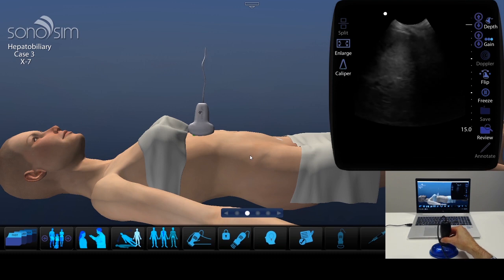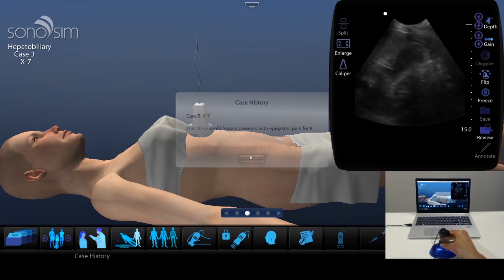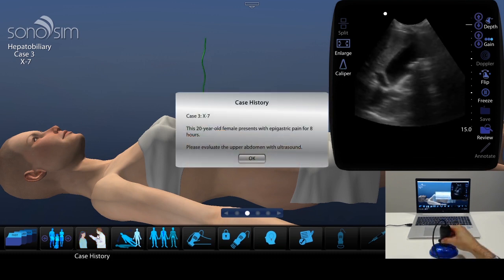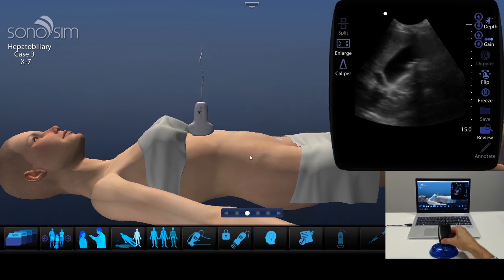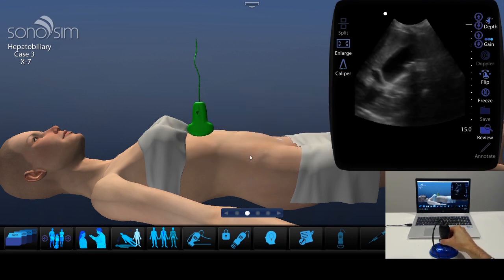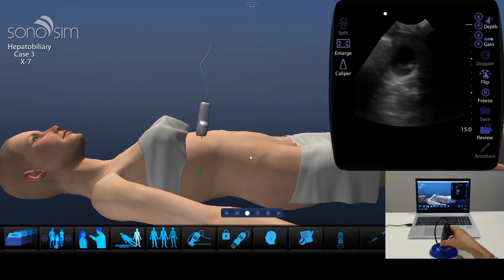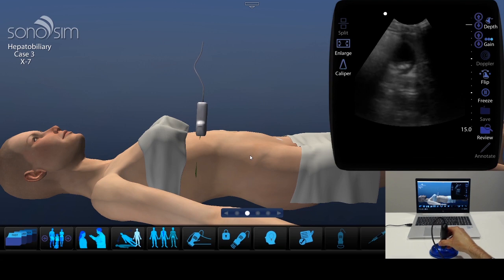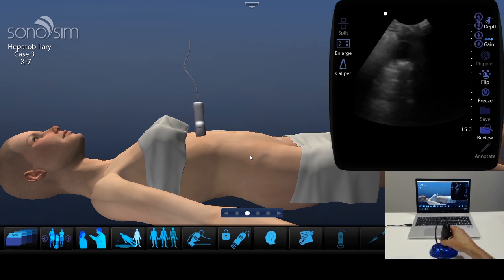For example, this case of a 20-year-old female presenting with epigastric pain for 8 hours. The probe on screen will match the movements you make with the probe in your hand as you rock, fan, and rotate.